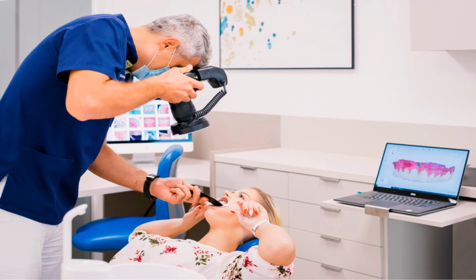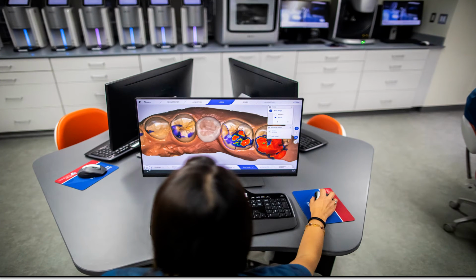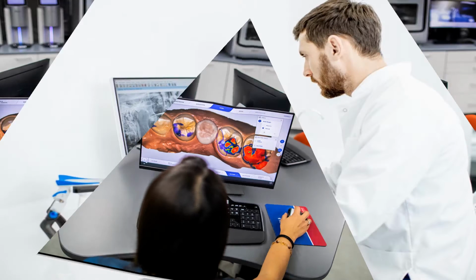Digital dentistry helps in the design of dental restorations, crowns and fixed partial dentures. FPD frameworks can be constructed. Digital dentistry improves productivity and quality of dental care. It is used in collecting, sorting and searching data. Efficiency and productivity are increased through computer appointments, recall and practice analysis programs.